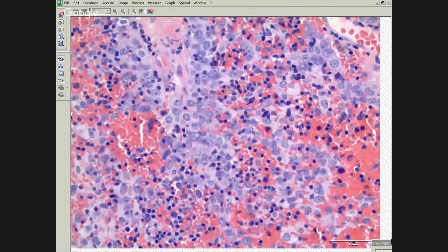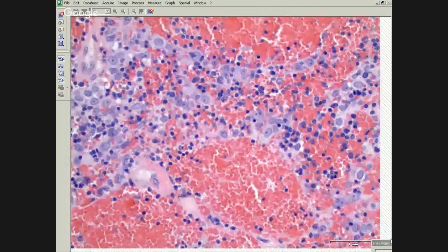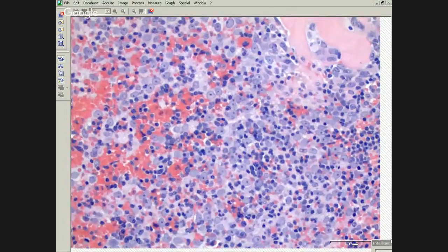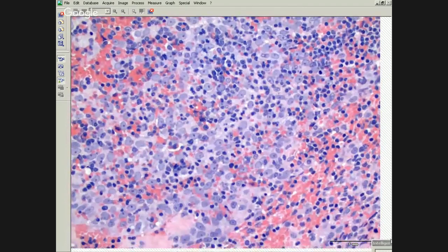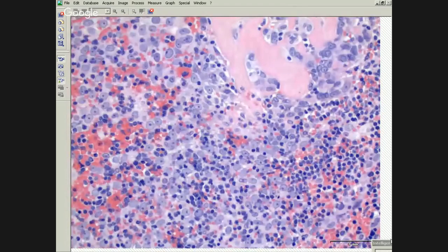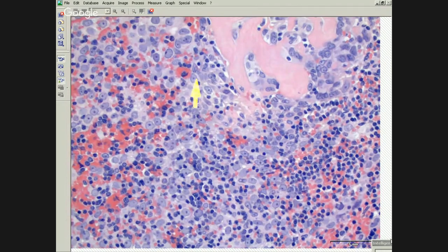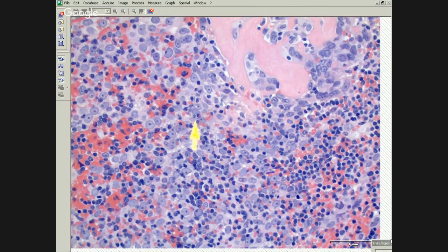Once again, clinician not telling us a key piece of information, that the patient had a thymoma resected last year. Wow. Now if you didn't know this, you can have certainly some sort of lymphoma might be in your differential here, having a component of larger cells with some smaller cells in the background. You can have a so-called lymphohistiocytoid variant of mesothelioma, so you might consider that in your differential. That's going to stain with keratin and your mesothelioma markers.